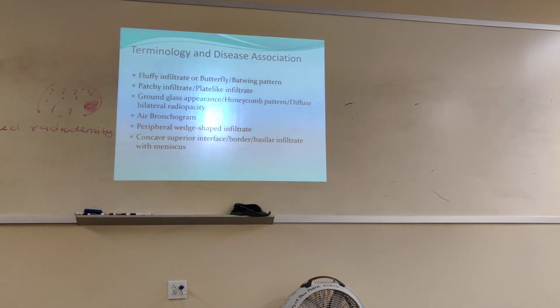Ground glass appearance or honeycomb pattern or diffuse bilateral radiopacity, that would be ARDS. It's like you're taking glass and then you're grinding it. Okay, ARDS. So if you describe a patient scenario and you say, well, ground glass appearance, I say, well, they got ARDS. Okay, or honeycomb pattern, ARDS. Okay?